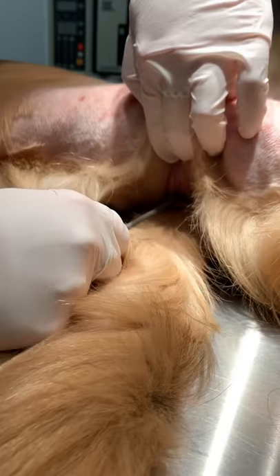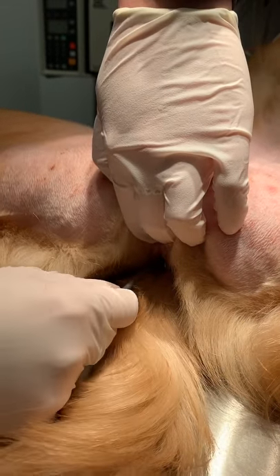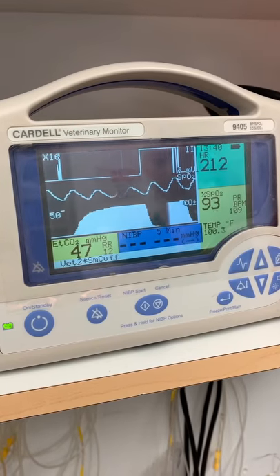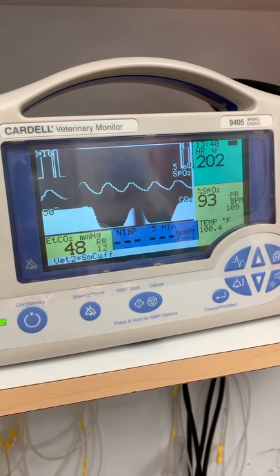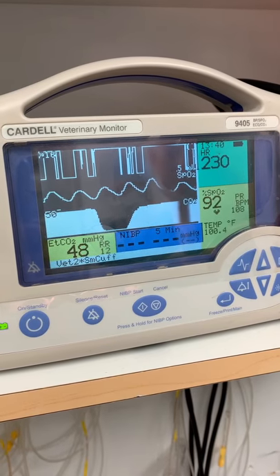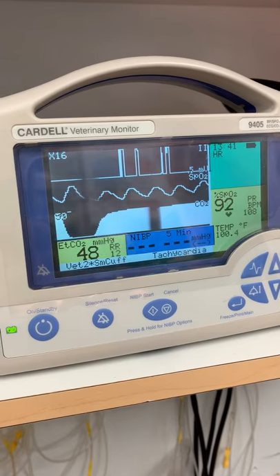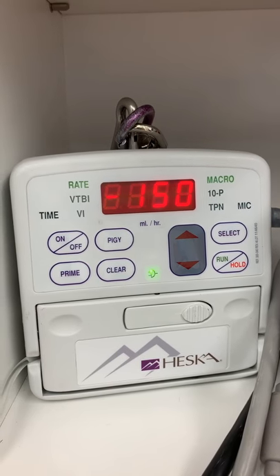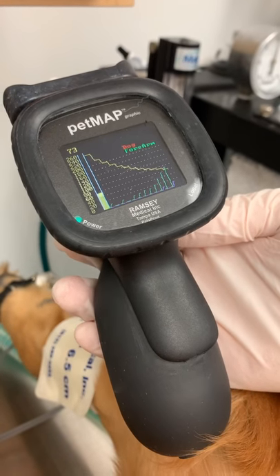So now we're placing a rectal thermometer to help us check his core body temperature during the procedure. Here we can see a number of different figures that we look at, including heart rate, oxygen concentration in the blood, carbon dioxide levels in the blood, core body temperature, and his intravenous fluid rate while he's under anesthesia. We are also checking his blood pressure to make sure that everything is as it should be while he's sedated.